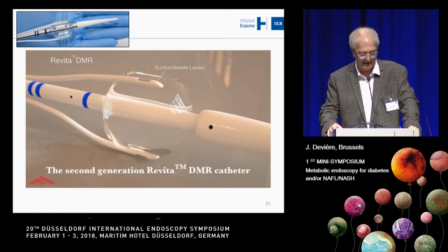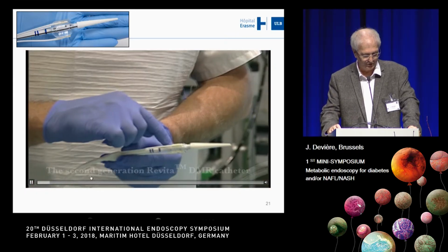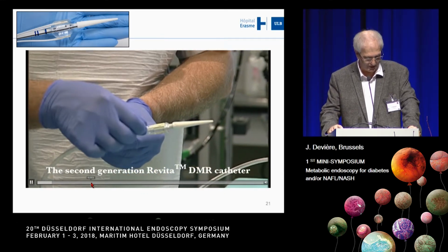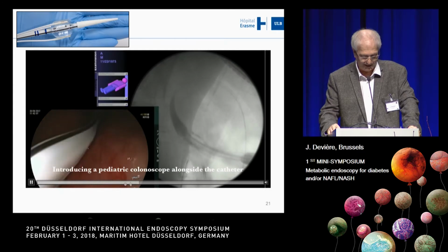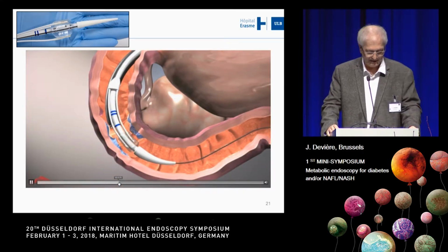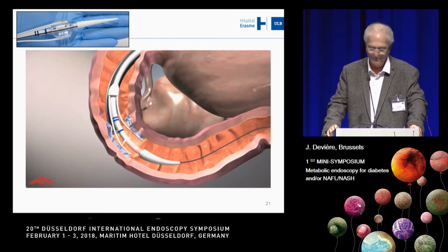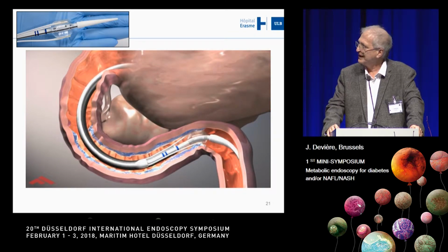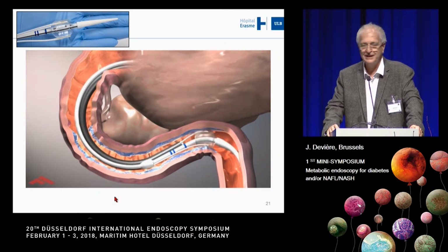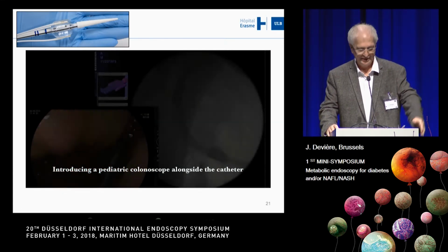So this is the example of a technique which has been developed by an American company. This is duodenal mucosal resurfacing, which encompasses the use of a balloon in which you can insufflate hot water, and you have side ports which are used in order to create a submucosal injection in this patient. The technique consists in going over a guide wire into the duodenum from below the papilla, then doing a successive submucosal injection, followed by ablation with hot fluid up to 94 degrees over the whole length of the third part of the duodenum up to the angle of Treitz, so ablating all the mucosa located between the papilla and the angle of Treitz.